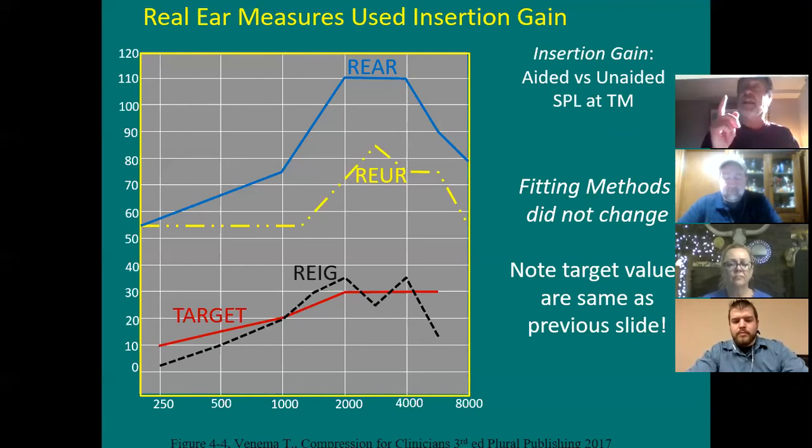And that's yesterday's real ear. We don't do that anymore. Some old clinicians still do, but most people don't do that anymore. The focus today is more on output. So real ear doesn't look like this now, but all real ear used to do this. I did this for years.